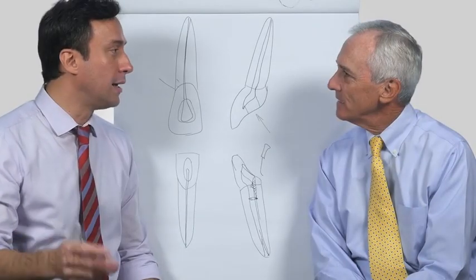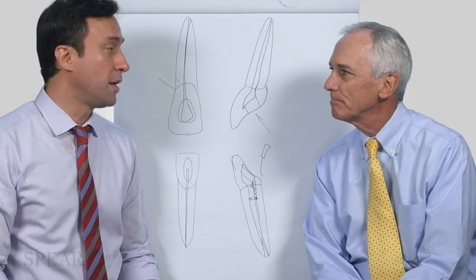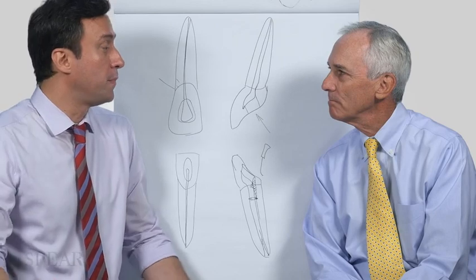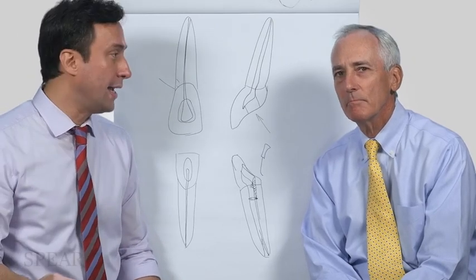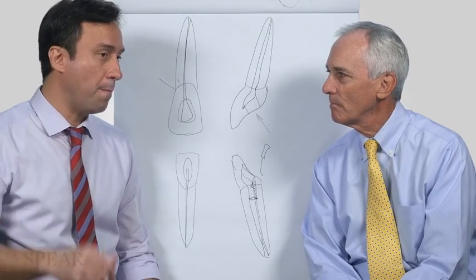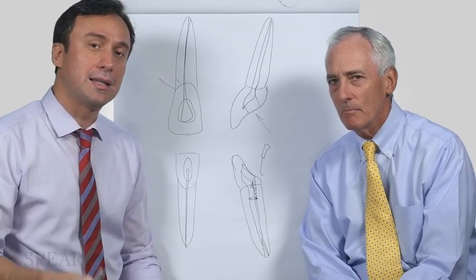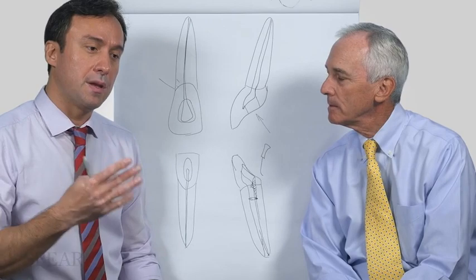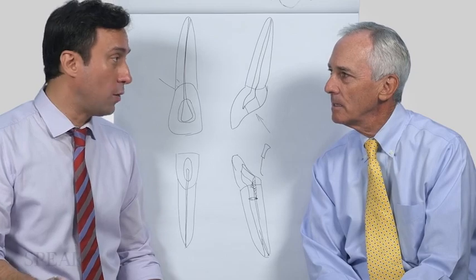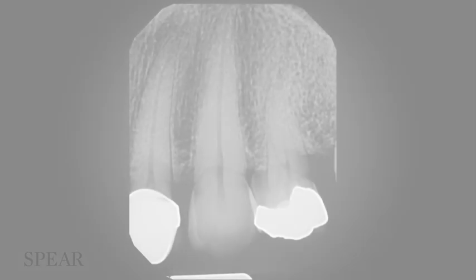Okay. Let's take a quick demo of a maxillary canine tooth that unfortunately ended up needing root canal therapy due to unknown reasons. Sometimes you get these virgin canines that end up becoming necrotic, and you wonder why. Sometimes it's due to trauma, and sometimes it's due to a little bit of root recession, which exposes the dentinal tubules in that area. Then you can get an infection of the pulp through the tubules. That happens when these teeth are completely virgin otherwise. So let's take a look at this canine tooth that was referred for endodontic therapy.